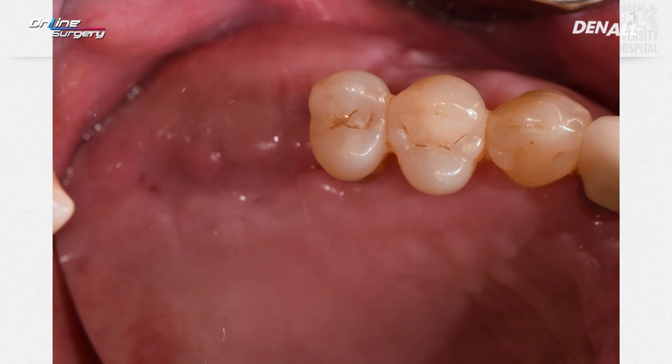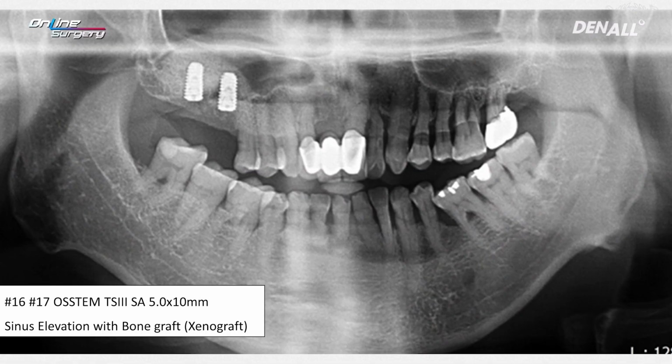Stitches were taken out after about 2 weeks. There was no sign of infection and the gum is very well healed. Post-op panorama, as I said before, distally bone grafting can be done without special efforts. Therefore, graft material should be put to the mesial side. The membrane should be detached and raised, and graft material needs to be applied by pushing it inside.